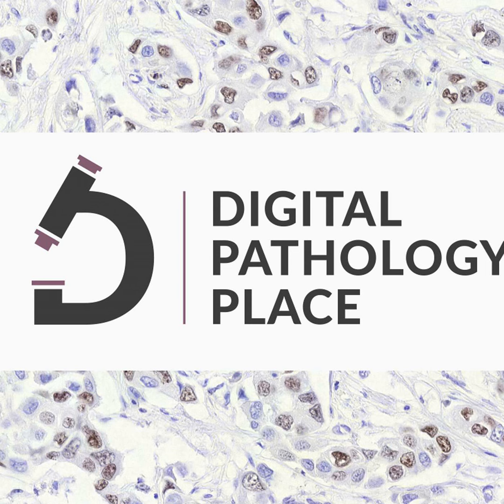Okay, you say it's the contour-based format, so that will be the vector annotation model rather than the bitmap annotation model. Right. We already have a bitmap annotation model. So the DICOM segmentation object, which is a rasterized bitmap, has already been extended to support the pyramidal tiled approach of encoding whole slide images that's used in DICOM, just as in, for example, TIFF or SVS.